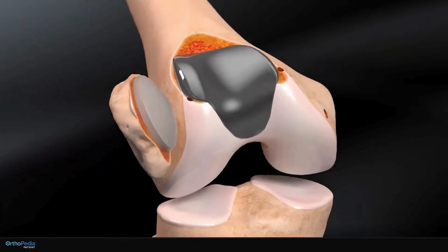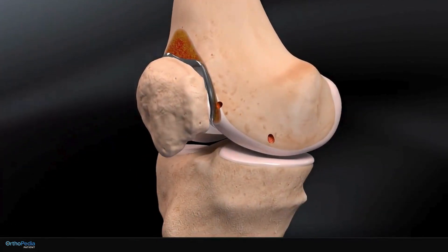The kneecap is flipped over and aligned back in place. The skin incision will be closed with sutures and the kneecap replacement is complete.